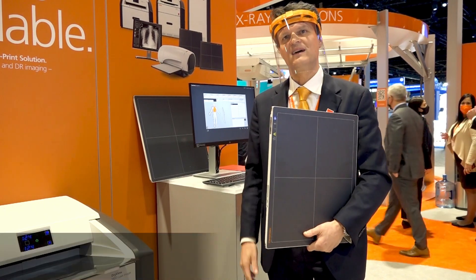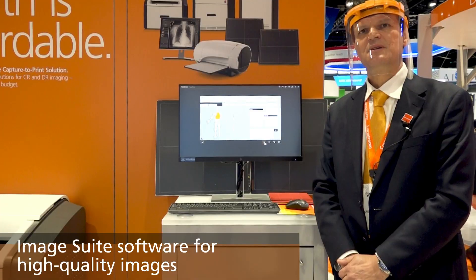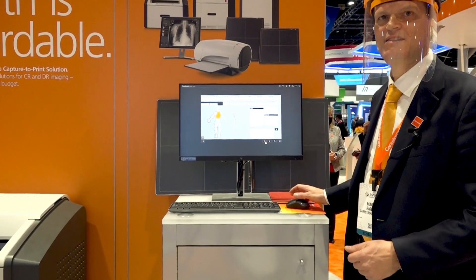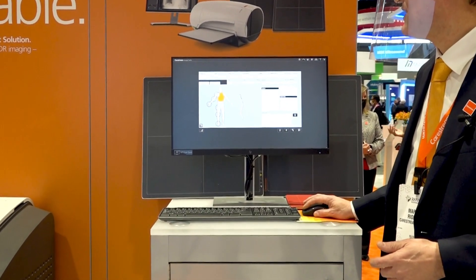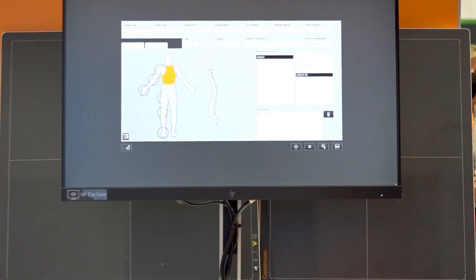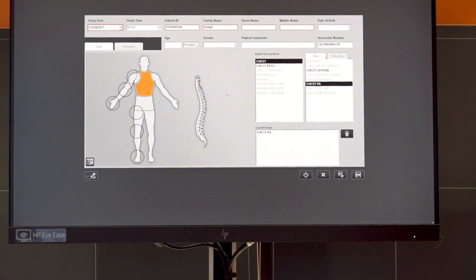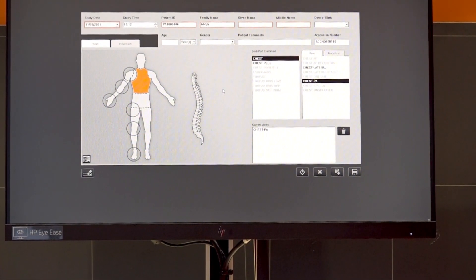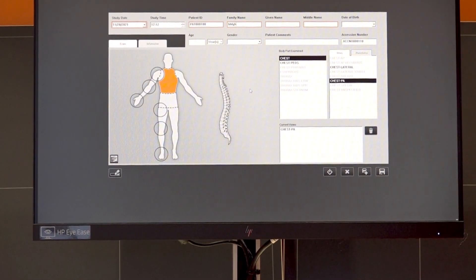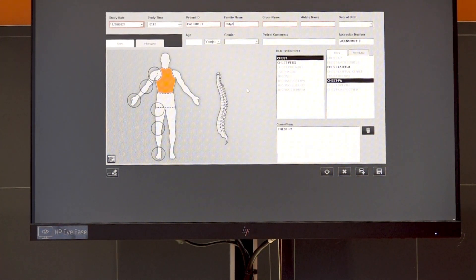Focus detectors are powered by ImageSuite software, the perfect solution for high quality DR imaging. Entering patient data is quick and easy — you can type the patient name, select your anatomy, and start the exam. The patient list can also be acquired from the modality worklist if RIS is available, or edited manually from the web client at the front desk. As soon as the detector acquires the image, it automatically transfers it instantaneously via Wi-Fi to the ImageSuite console for your review and editing.